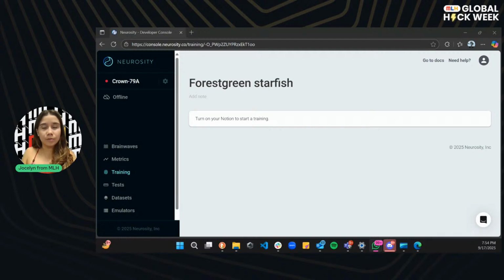So right now I'm trying to find a way so I can connect the headset and actually show you how it's used. Because without giving the live demo, then there's no point of showing you how it works, because we already learned all of the theoretical concepts that are in there. So hopefully, we can get that live demo working for you all, and you can also keep it recorded in case that we want to see it again later on.